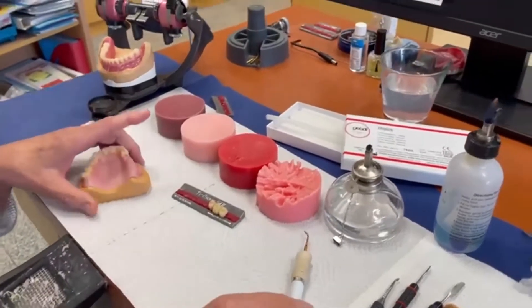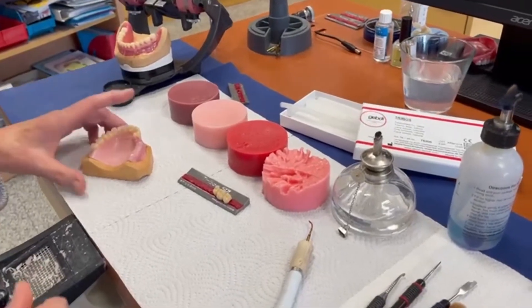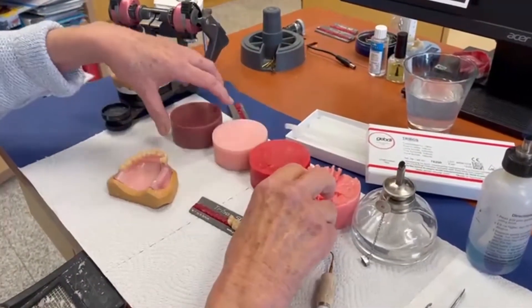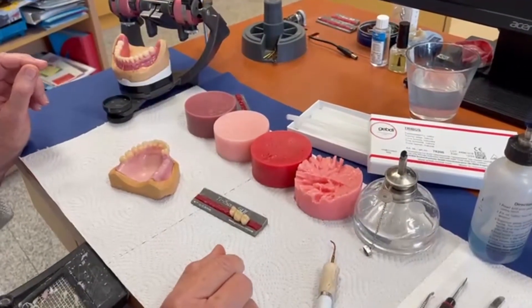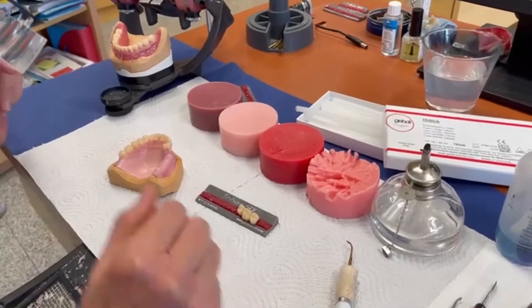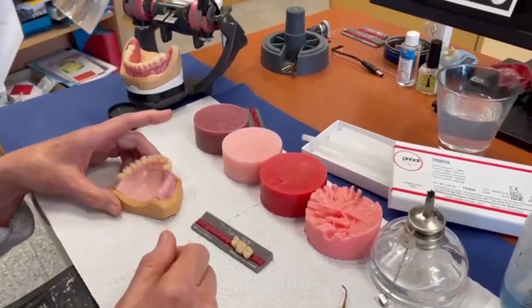Good morning ladies and gentlemen, good morning laboratories and technicians. We are back in our laboratory and today we want to show you the idea to make full denture works or partial denture works. Andrea starts today with a product called tunnel wax.